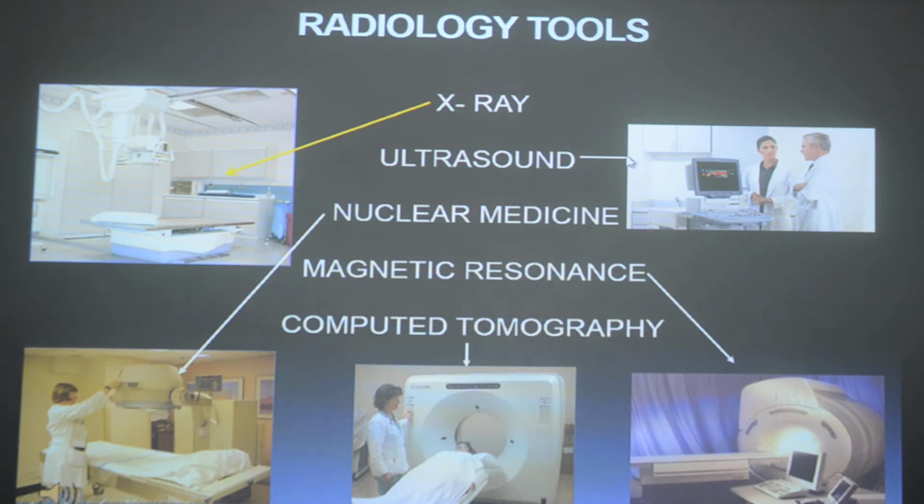Okay, ultrasound. Ultrasound again has a limited role. In children, when the skull is not calcified and it's still membranous, you can use the fontanelle and you can use the probe and image the brain in a child or in a neonate. But in adults, when you have the skull which is calcified, you cannot see the brain through the bone. So obviously, it has a limited role.